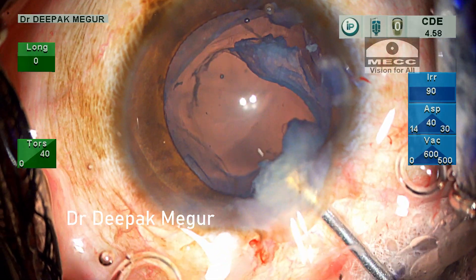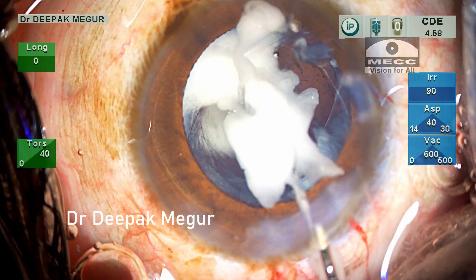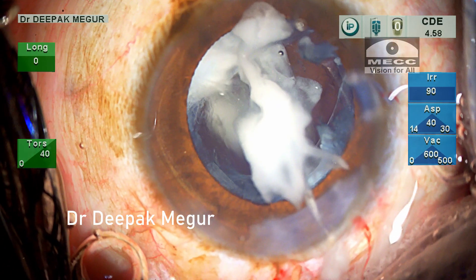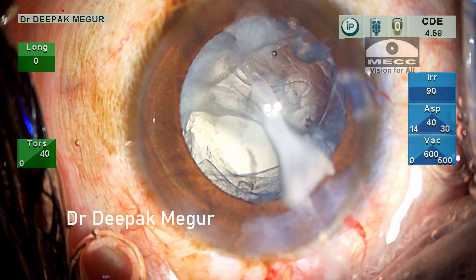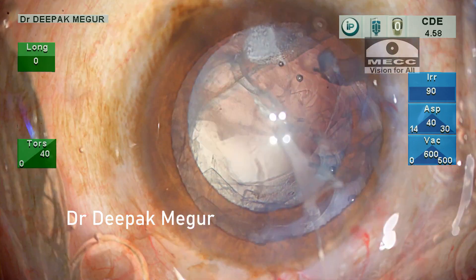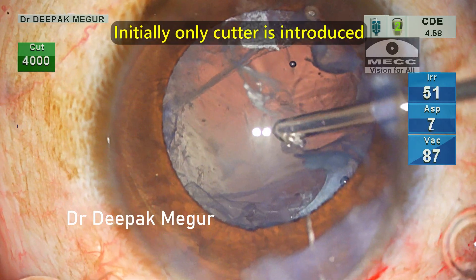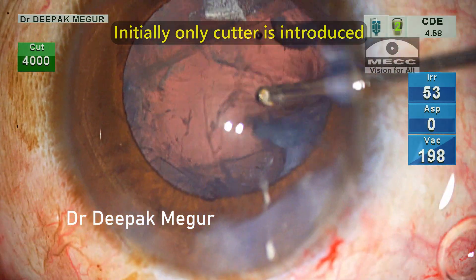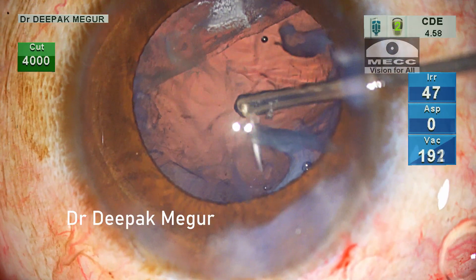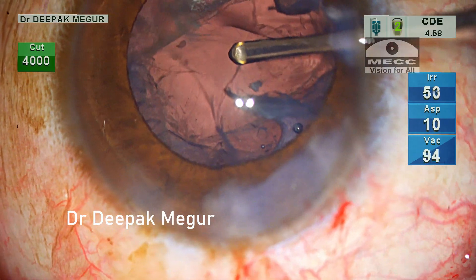Once the fragments are out, I use diluted Triamcinolone Acetonide to confirm vitreous prolapse. Yes, vitreous disturbance is noted as it is highlighted by the staining of the Triamcinolone Acetonide. Time to do bimanual anterior vitrectomy. To begin with, I enter with my cutter alone and hold it at the level of the PC tear, and as soon as the cutting and aspiration is begun, the vitreous anterior to it is cut and aspirated into the probe.